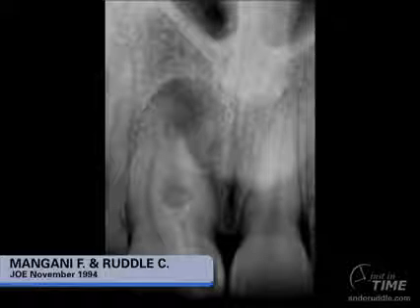Here's a case that was published in the Journal of Endodontics in 1994. This case was done by my friend Francesco Mangani, and you can see it's a very unusual central incisor. In fact, this right maxillary central incisor is a dens invaginatus. It's a virgin tooth, but through the lingual groove, there was an ability for microorganisms to get into the pulp chamber, and you can see that there's multiple canals, there's internal resorption, and there's a diffuse asymmetrical periradicular lesion.